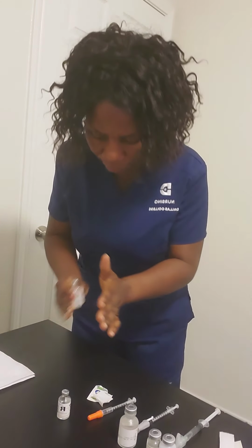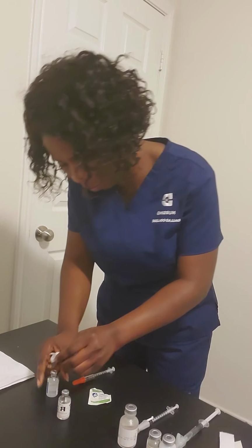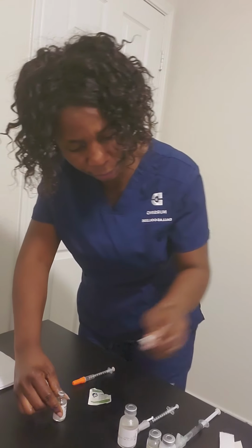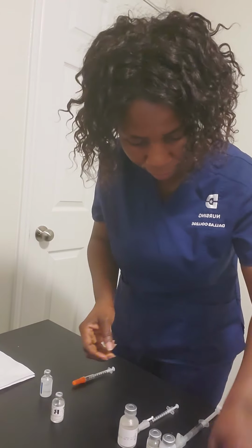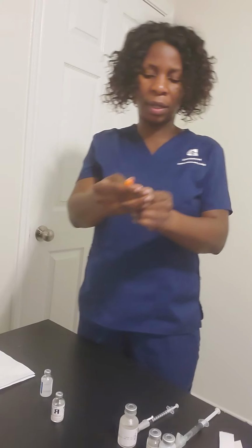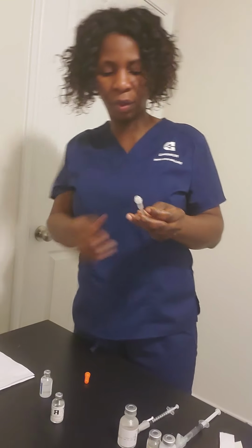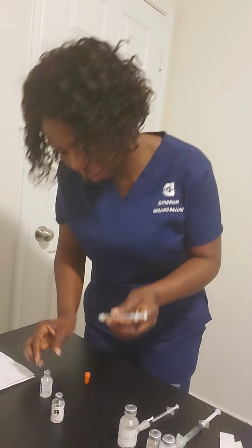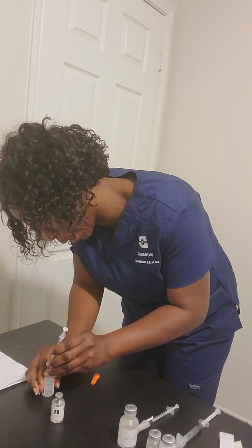As I roll that, I'm going to now clean the top of the vial. After cleaning, I'm going to take off the cap and draw 12 units of air into my syringe, and I'll drop the air into the NPH.